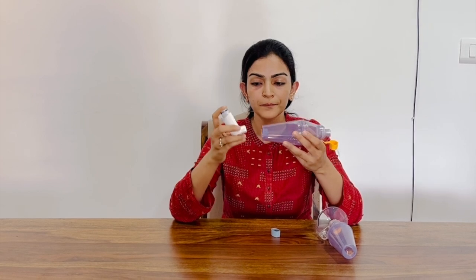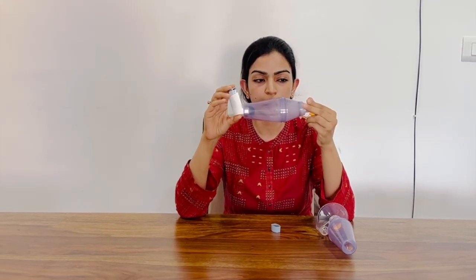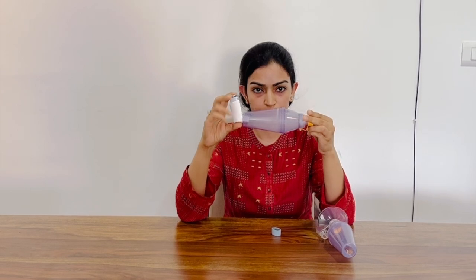So the first step is to shake the inhaler well. The second step is to attach the inhaler to the spacer. The third step is to release the medicine by an actuation, put the spacer in the mouth, creating a proper seal around the spacer with your lips. And then the child has to take 8 to 10 deep, slow breaths so that the medicine goes into the lungs like this.